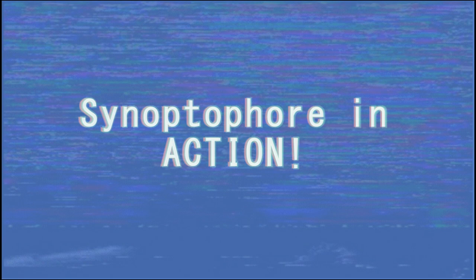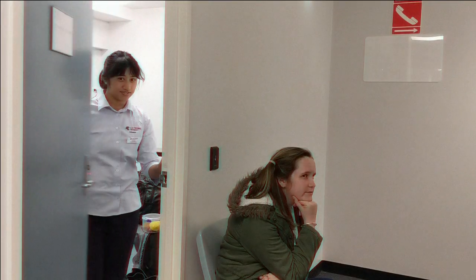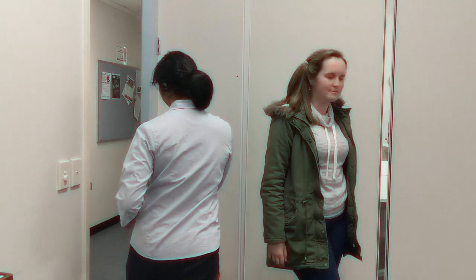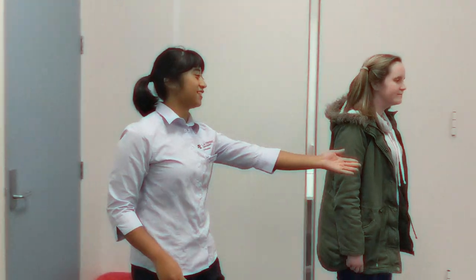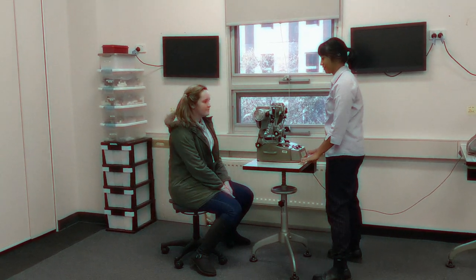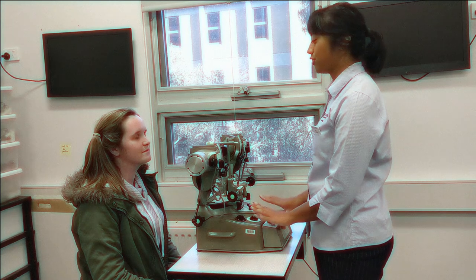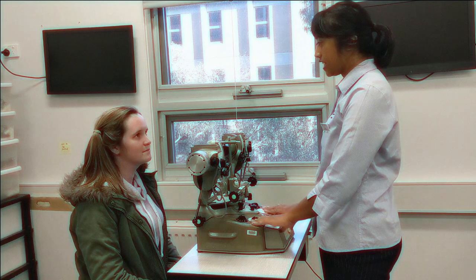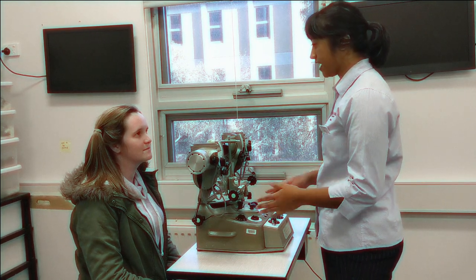Here is the synoptophore in action. The clinician greets the patient, and introduces herself: "Hi, my name is Simone. I'll be here on placement today, and today I'll be doing a synoptophore test. All that it is, is to check if your eyes are working fine together and they're aligned."